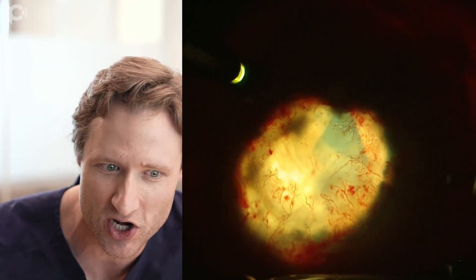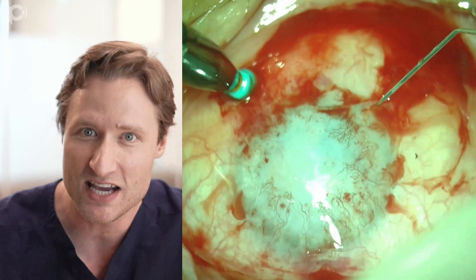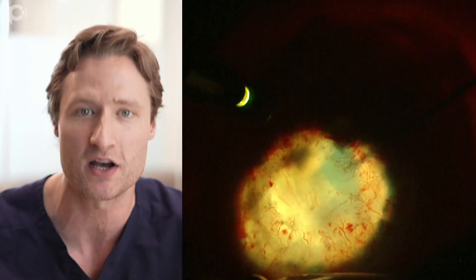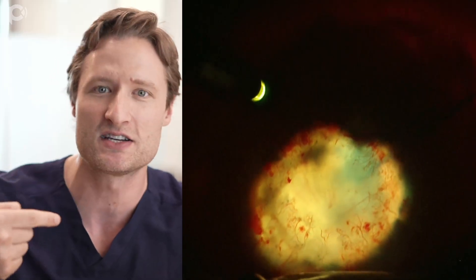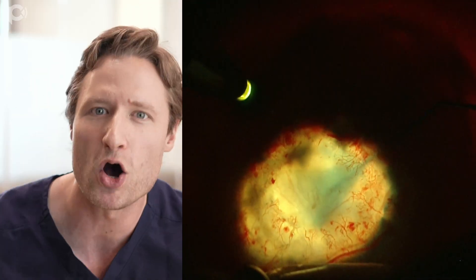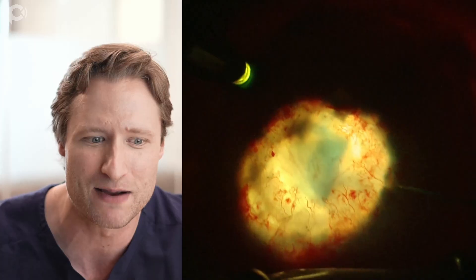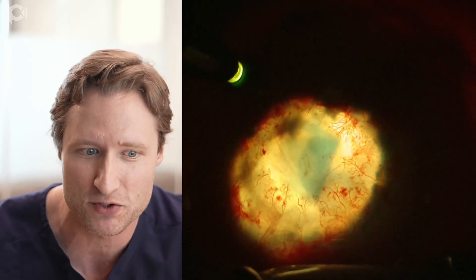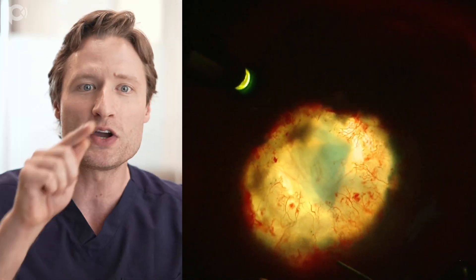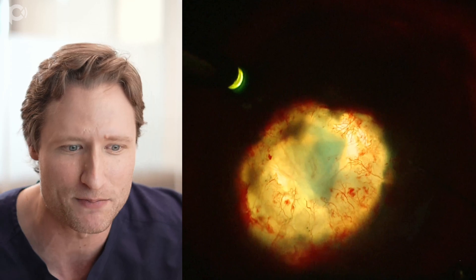So I didn't deepen the chamber - all I succeeded in doing was wedging the graft into the angle. Typically, you cannot bump the graft out just by taps on the surface of the cornea. So I'm going in through that paracentesis and directly engaging the graft with the tip of the cannula, poking it out of the angle. That took me a long time to learn. When you have an angle-trapped graft, what you should be doing is deepening the chamber and poking the graft out with the cannula, rather than trying to bump it out with taps on the corneal surface.